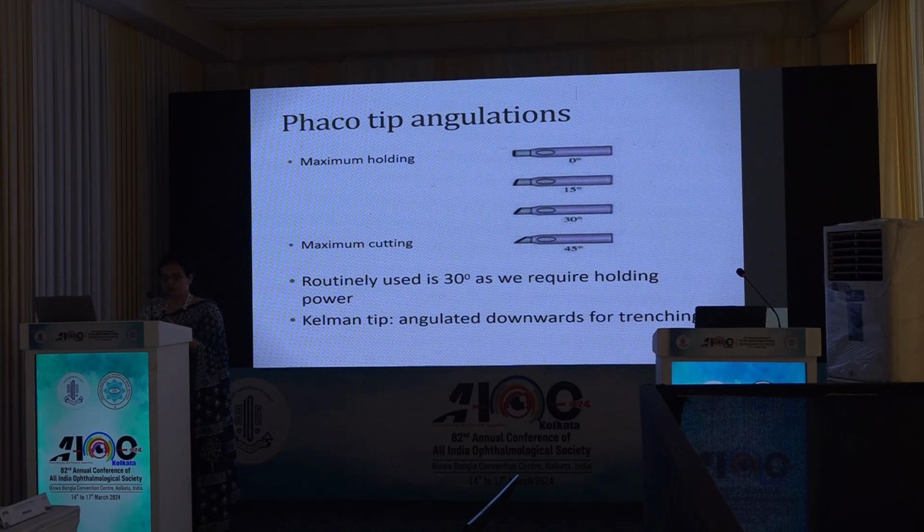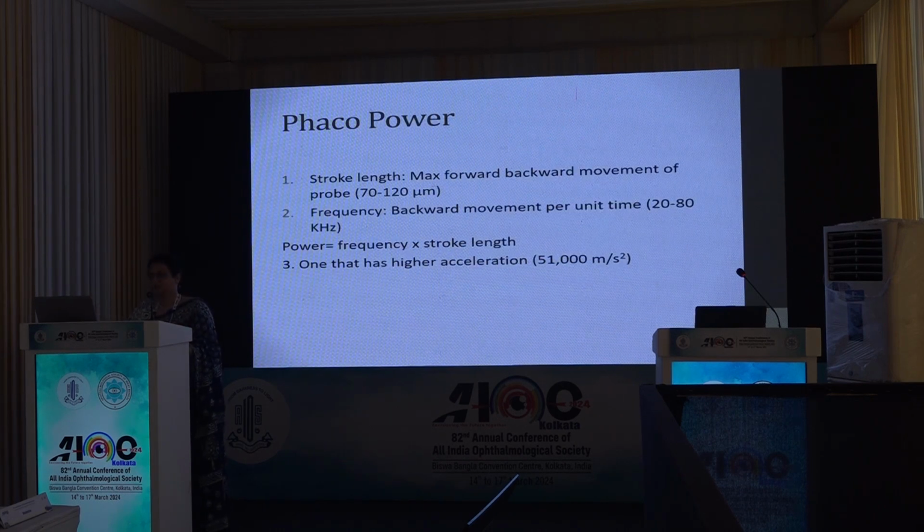0 has the maximum holding power and 45 has the maximum cutting power. Routinely we use 30 degree with a good holding power, because for cutting we already have the power of the machine. There is a Kelman tip present which has the angulation downwards, especially for trenching.